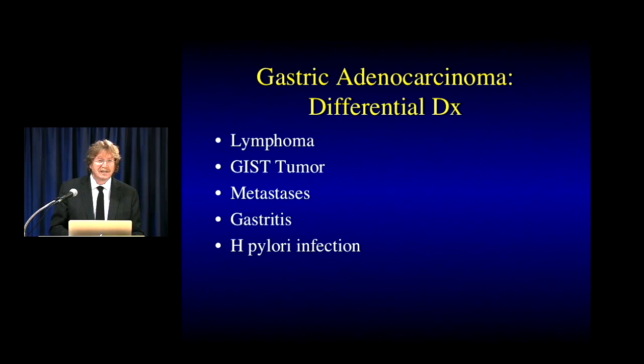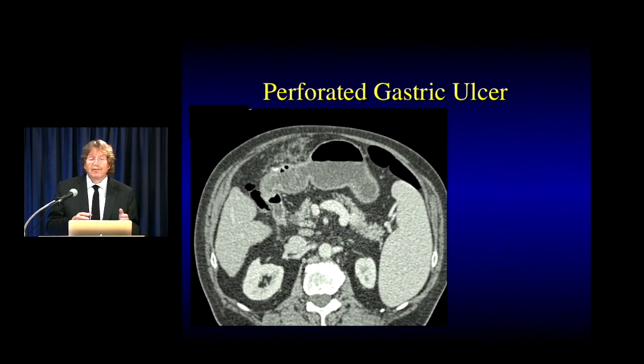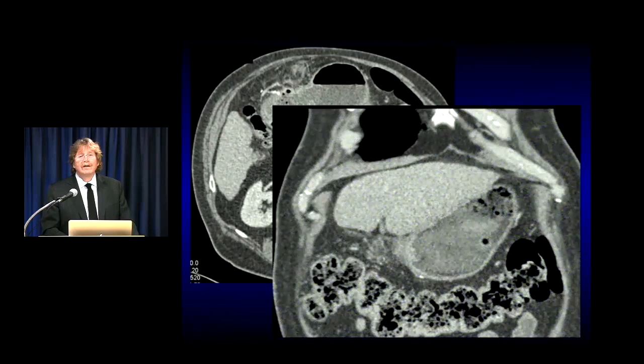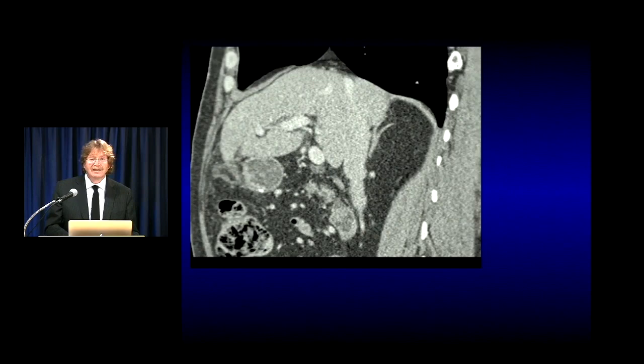For example, a perforated benign gastric ulcer produces stranding around the stomach, which always raises concern about carcinomatosis. Also, if you have a gastric cancer that's perforated, you may tend to overcall the extent of disease — thinking it has spread into the omentum or mesentery when it's simply the perforation. You need to be very careful: when you have perforation, you can overcall the extent of disease. One case was a perforation due to gastric cancer, but there was no carcinomatosis — it was simply secondary to the inflammation.